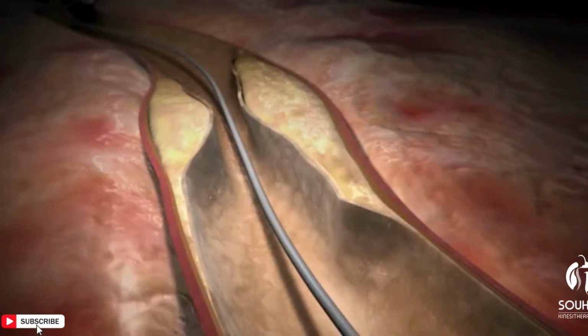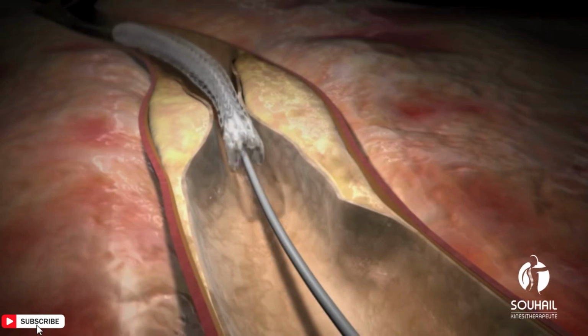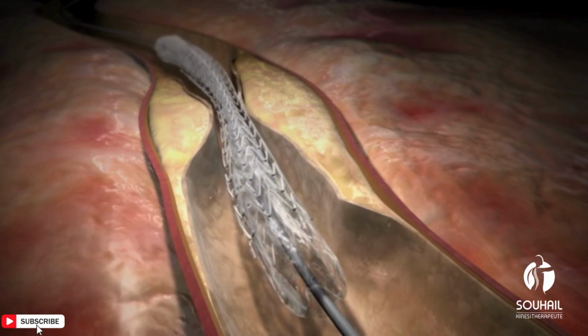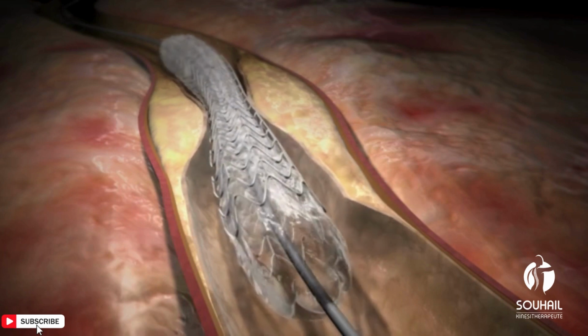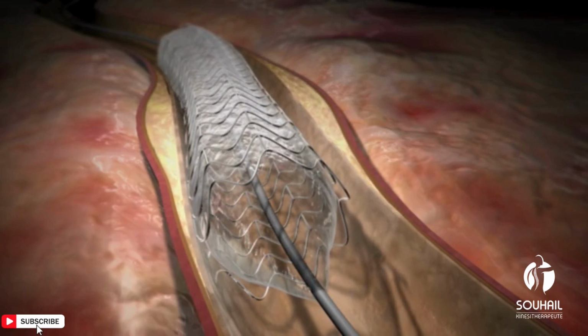Procedure. Preparation. The patient is typically given medication to relax and may receive local anesthesia at the site where the catheter will be inserted, often the groin or wrist. Insertion of catheter. A thin, flexible tube called a catheter is inserted into the narrowed artery under guidance from imaging techniques such as fluoroscopy or angiography.